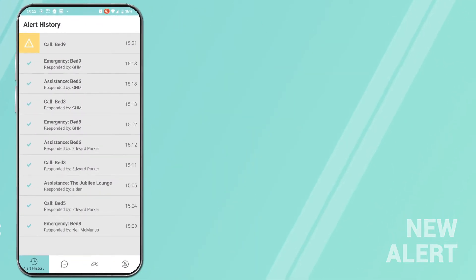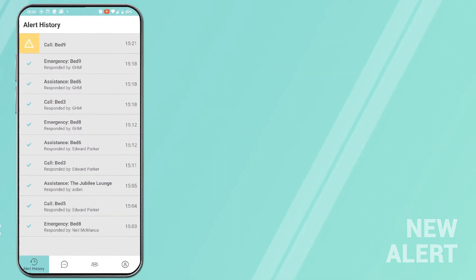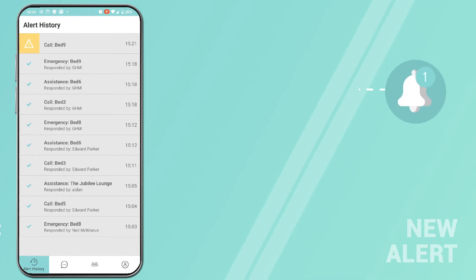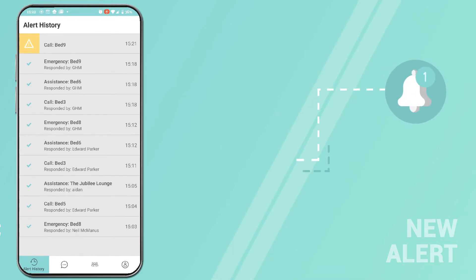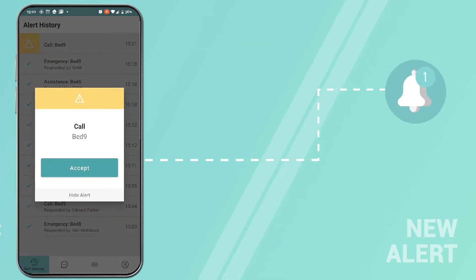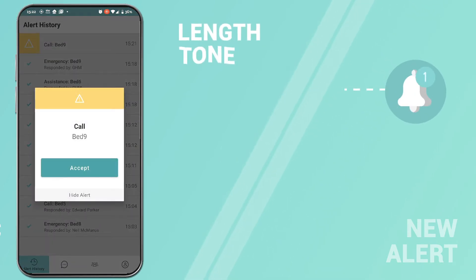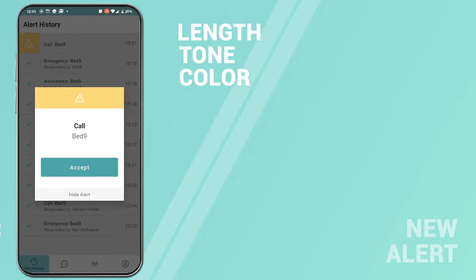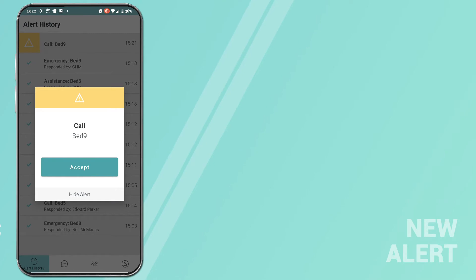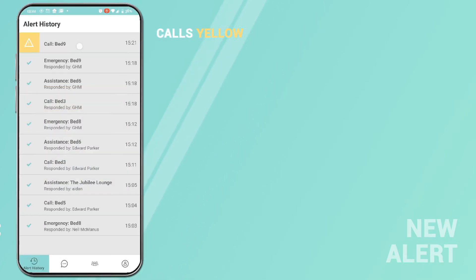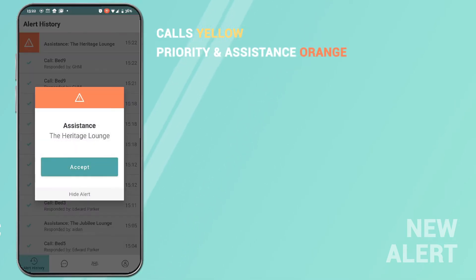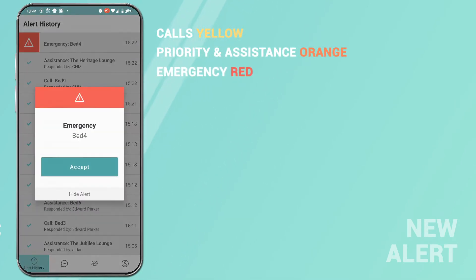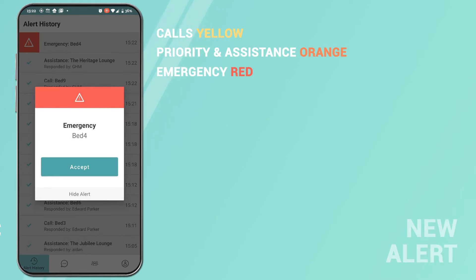New alerts generated in the nurse call will be pushed to the Nexus app. The length, tone and colour of an alert depicts the priority level. The priority levels are: calls and yellow; priority and assistance, orange ; emergency, red.